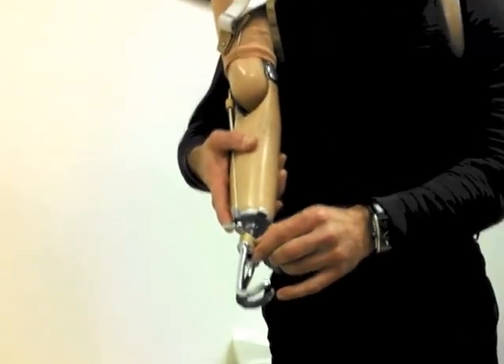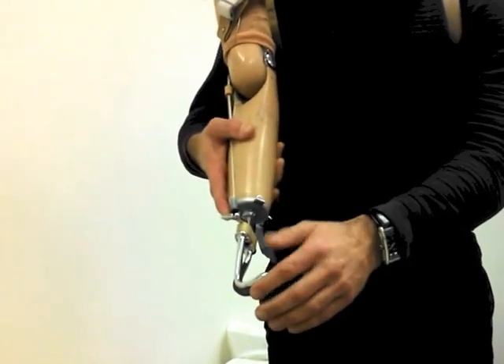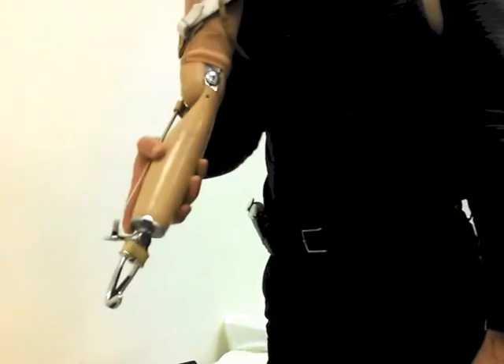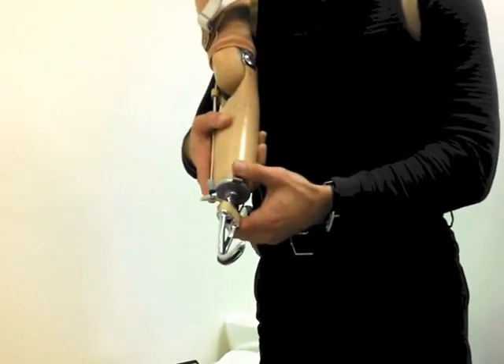I have some patients that wear 10 or 11 of these bands, and that's about 20 pounds of pinch force. So you can hold something really strong with this. This can come off, and you can put a hand on just like this — to interchange, you take one off and put the other one on.